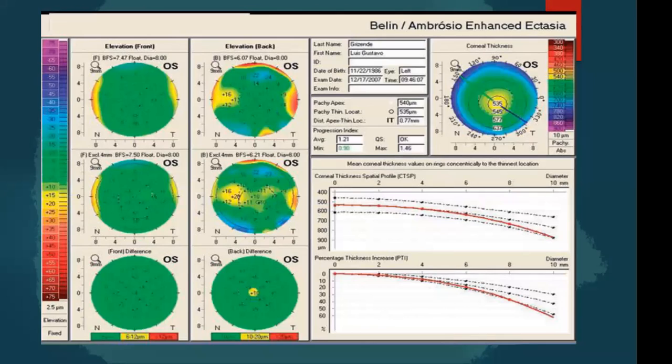There is no such comparison between the two. But they both have their own specialities, I would say. Like a Placido doesn't have a posterior analysis, it wouldn't measure the central 3 mm, whereas the Scheimpflug would do all of this.